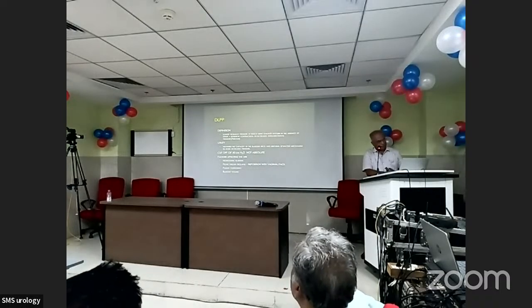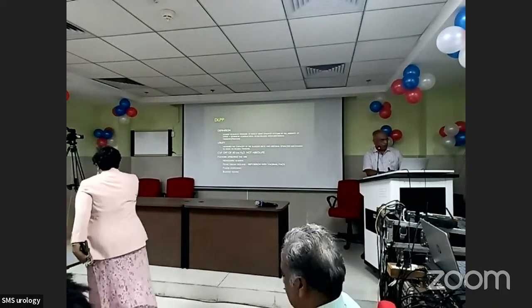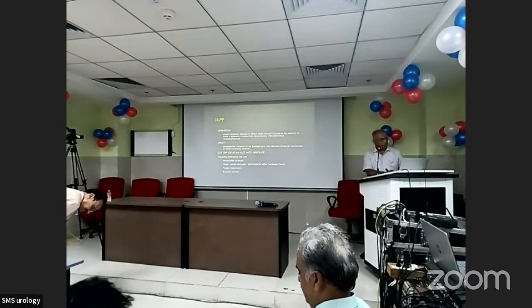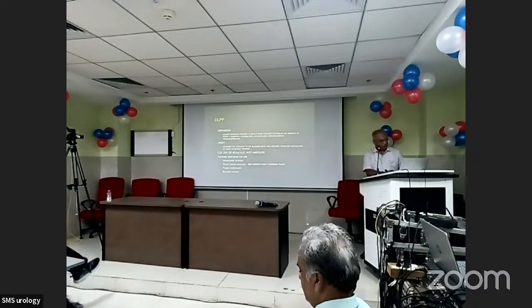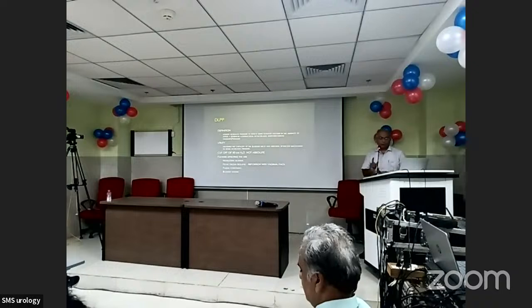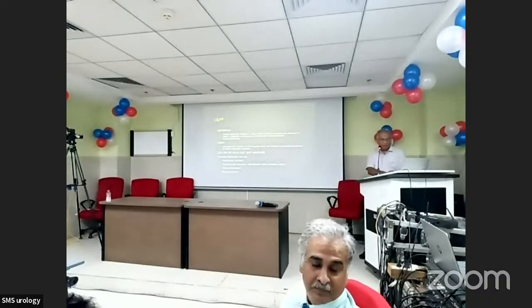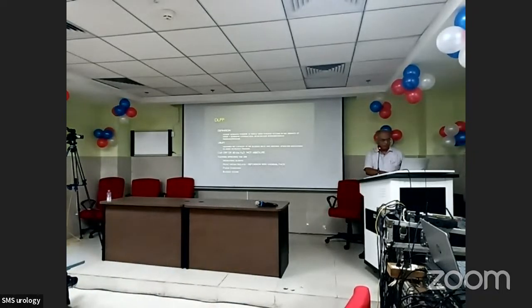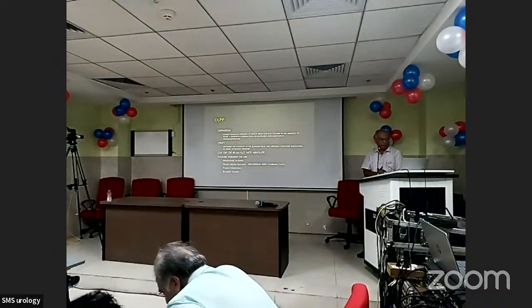What are the factors affecting this? Neurogenic bladders, pelvic organ prolapse. We can reposition the prolapse with a vaginal pack and then study. Patient positioning may affect this, and the bladder fill volume. It is most useful in patients with lower motor neuron disease, like spina bifida, spinal cord tumors, after abdominoperineal dissections, radical hysterectomies. These are the cases in which detrusor leak point pressure might be helpful. So the higher the DLPP, the more likely it is that upper tract damage may occur.